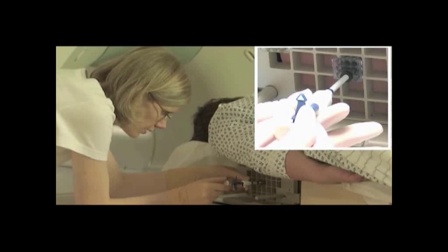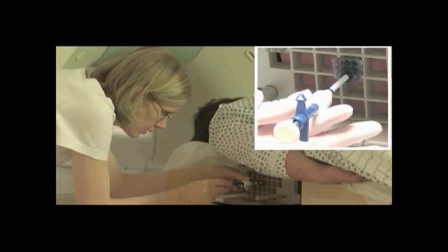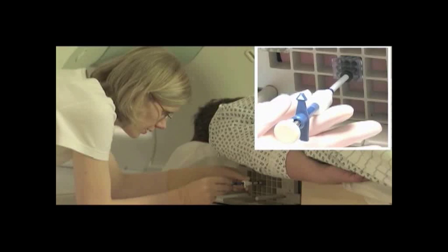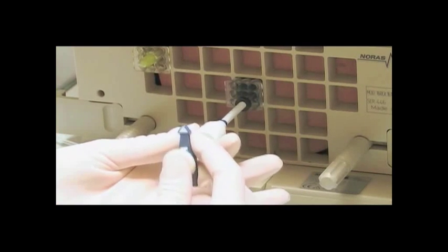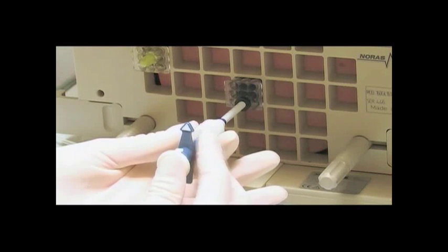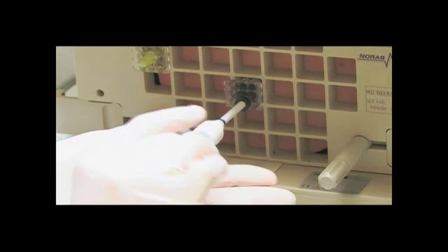To make sure this position is maintained throughout the deployment of the marker, hold the device in place with your free hand. Deploy the marker by pressing the plunger with your thumb. An audible and tactile click will confirm deployment.